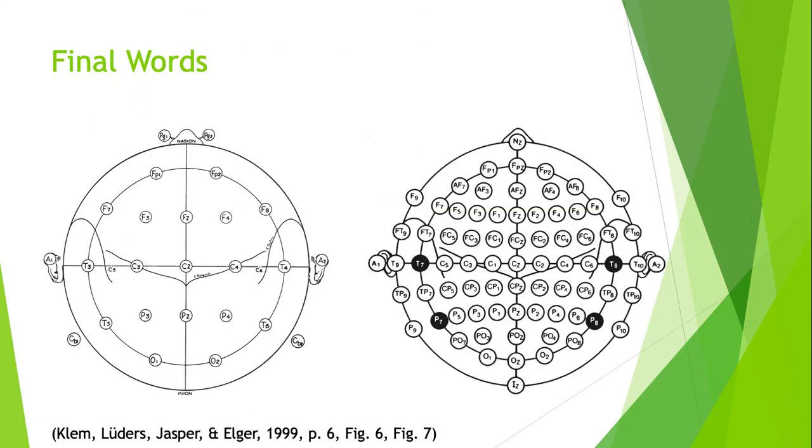To conclude, I think it was important to end with yet another diagram, as direct visualization of where these electrodes are placed is key to actually learning their appropriate positions via measurement. In a standard polysomnogram, again, only 6 exploring electrodes are utilized for brainwave monitoring purposes, and these are the electrodes that we located today.